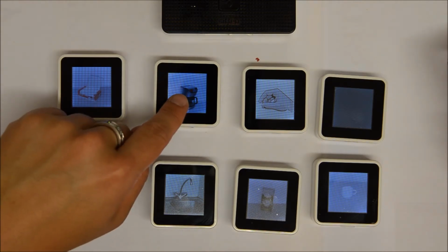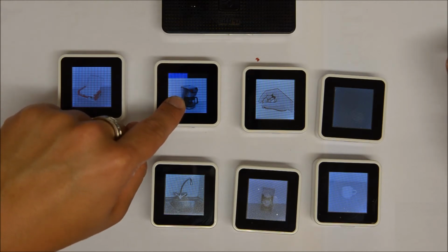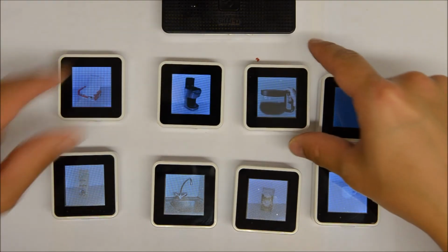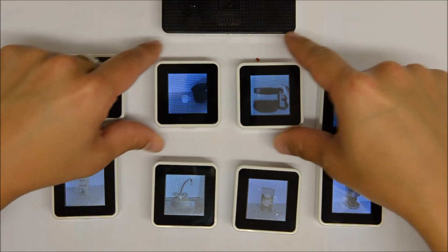So this is to make coffee. We hold that for 2 seconds. As you can see, the progress bar fills. There's no animation in this particular task. So that's the coffee made. Take the coffee out. And then put that to the task.